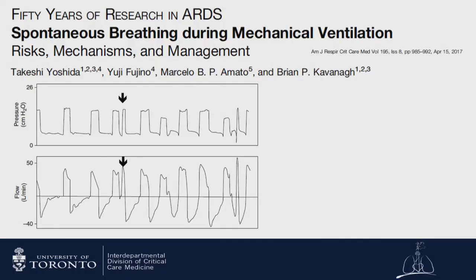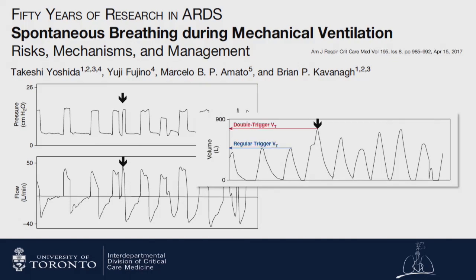And finally, here's just one more example of double triggering. In the middle example with the arrows here, the patient has initiated the breath. You can tell that because there's a small deflection in the pressure time tracing just before the breath has started. But as soon as the ventilator has cut the breath, it's reinflating again because the patient is still making an effort. And you can see that in this example, this results in a measured tidal volume that's significantly larger than our target tidal volume.